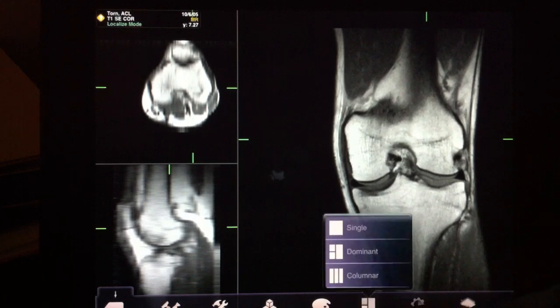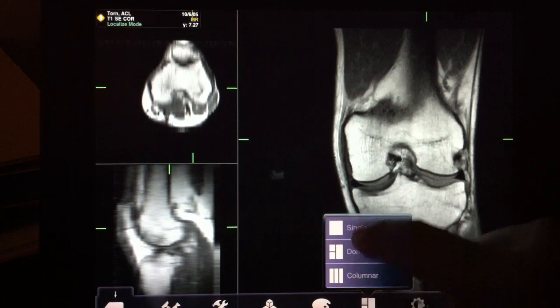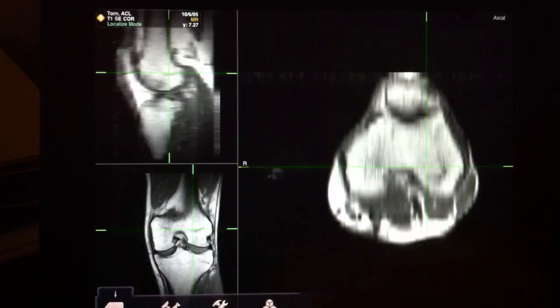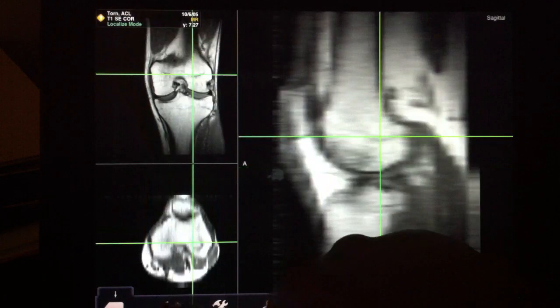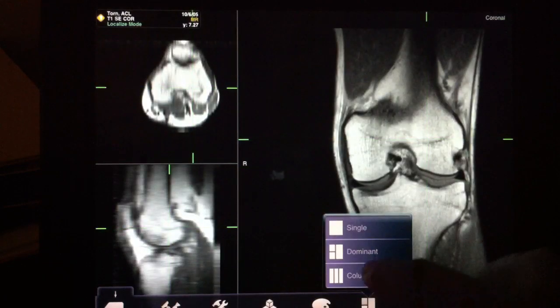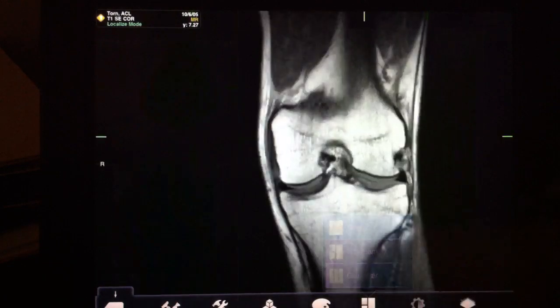You can change which of the three views is in the dominant position by rotating through like this, and you can go back to the single mode we started in.